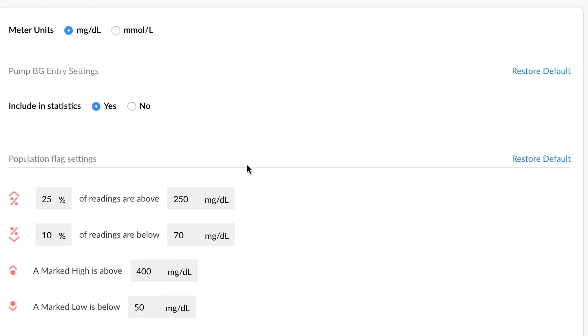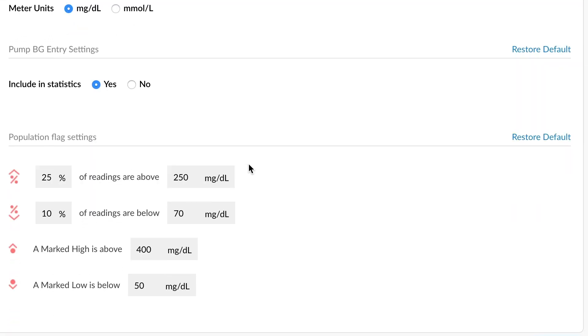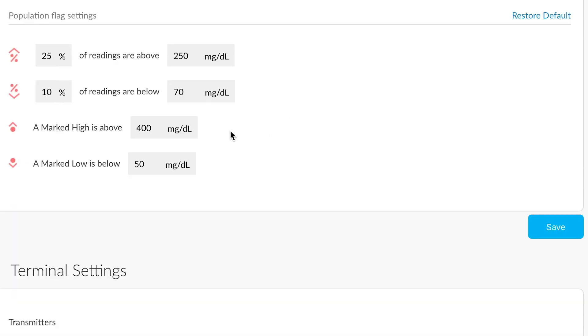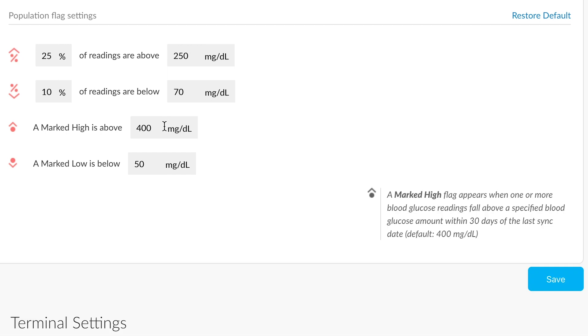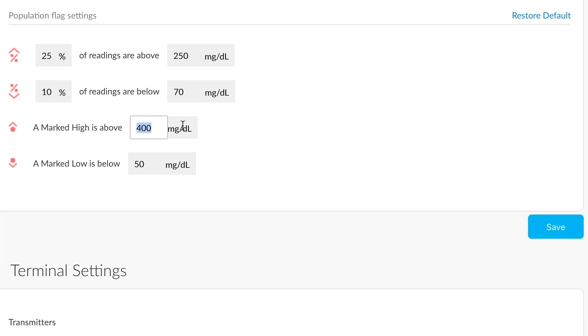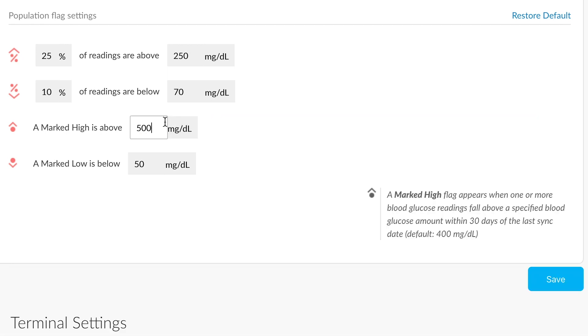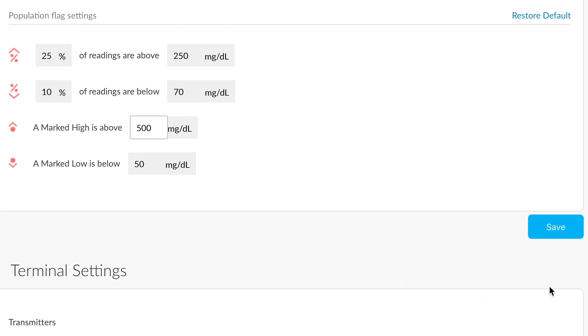Going down further, we have data settings. And much like earlier when we were looking at modifying a patient's specific flags or data settings, you can do this for your entire population. So for instance, if we wanted to set a value of 500 as a high for our entire population, we can do it from here. Don't forget to push Save.